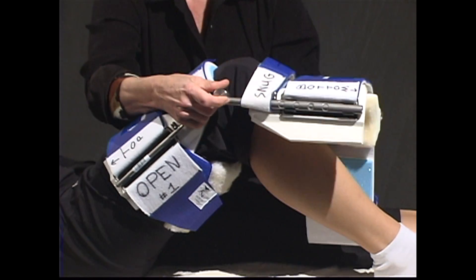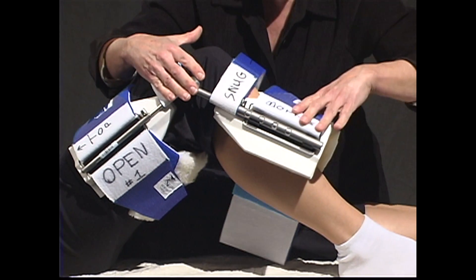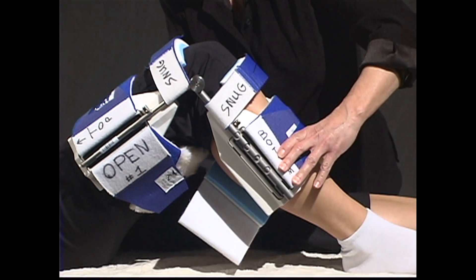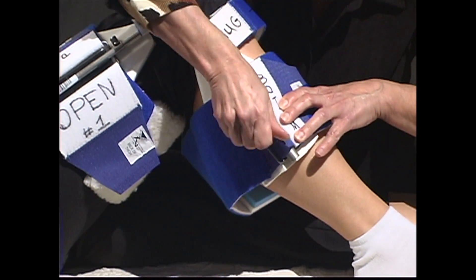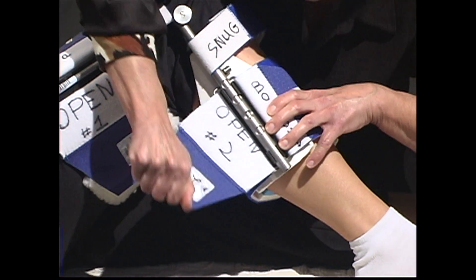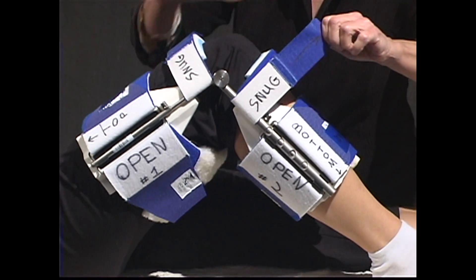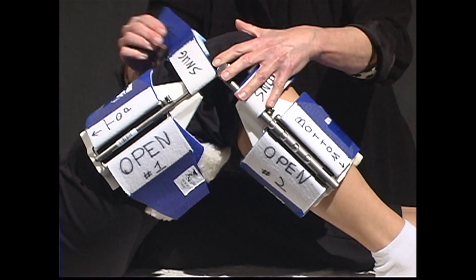Snug the small two-inch blue straps on either side of the knee. Push the bottom of the splint towards the calf and insert the cuff through the D-ring, wrapping it around until you see the line drawn by the consultant. Snug the straps on either side of the knee if necessary.